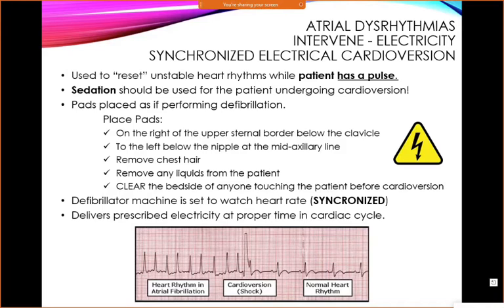And the important thing to remember, the difference between cardioversion and defibrillation, it's still the same patches, it's still the same defibrillator. What you're doing is someone who is ACLS qualified, and actually a doctor is with you when you do this. This is not really an emergency thing. This is a planned procedure. The patient has a pulse, and we are synchronizing our shock so that it doesn't go in the wrong part of the cardiac cycle.